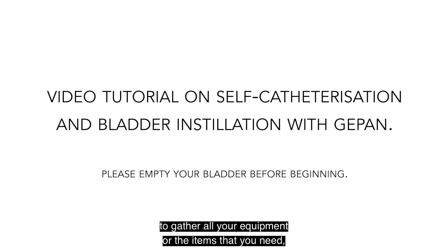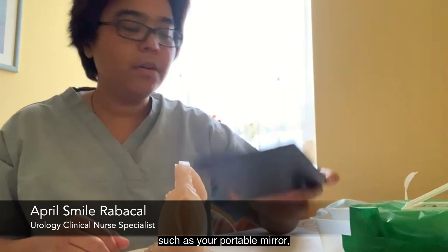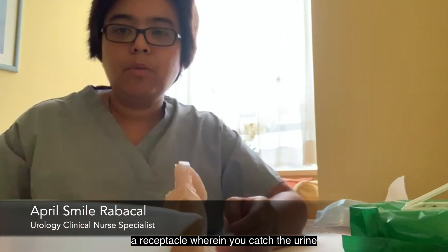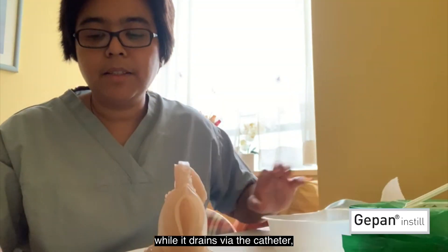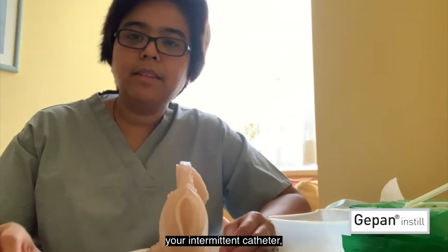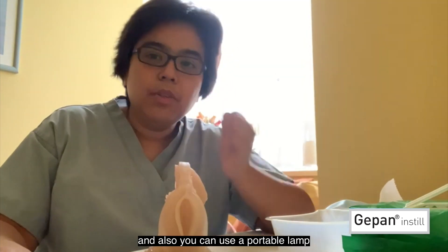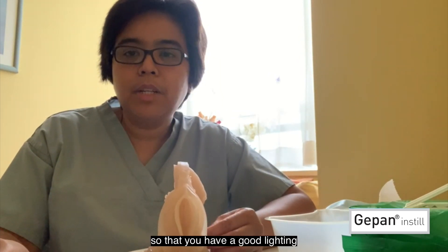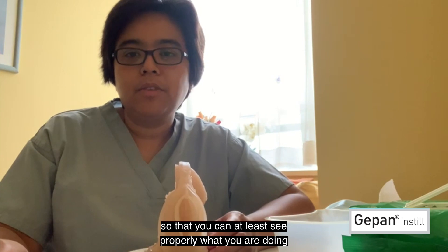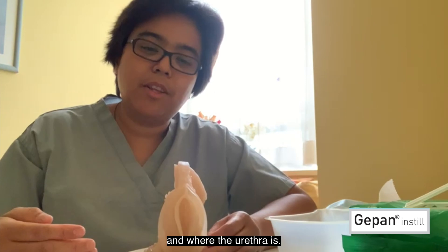First thing that you need to do is to gather all your equipment or the items that you need, such as your portable mirror, a receptacle wherein you catch the urine while it drains via the catheter, your intermittent catheter. You can also use baby wipes for cleaning, and you can use a portable lamp so that you have good lighting to see properly what you are doing and where the urethra is.